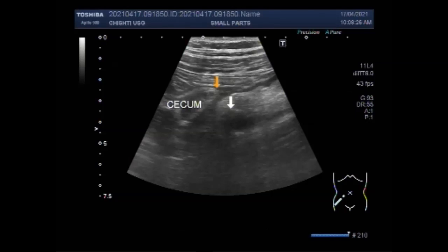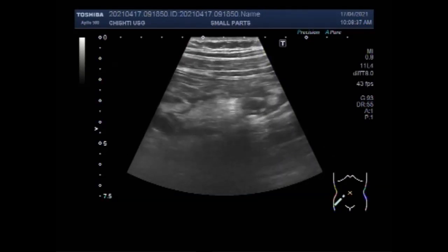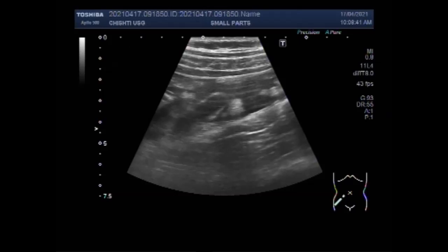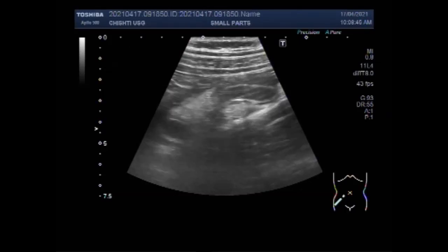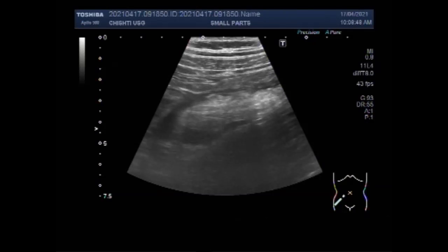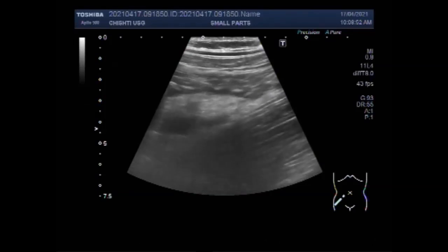This is a case where the patient is experiencing intense pain in the right iliac fossa. When acute appendicitis is suspected, you can scan the patient lying supine, and it is preferable to select a high-frequency transducer from 7 to 11 megahertz. You may put a pillow under both knees to have the abdomen of the patient relaxed. You will search for a blind tubular structure arising from the cecum.